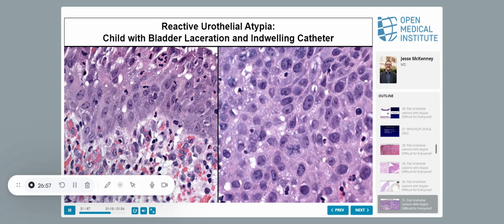Well, we had to go chase this down. Because we saw the patient's age, you just wouldn't diagnose urothelial carcinoma in situ in a 5-year-old. This picture is in an adult. It's atypical. No, this picture's from the kid. This is from this patient.